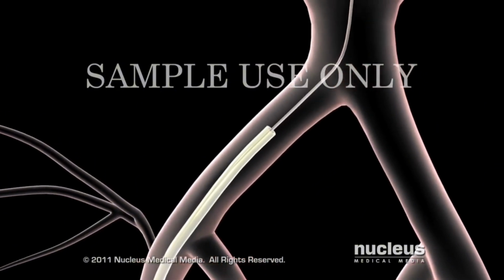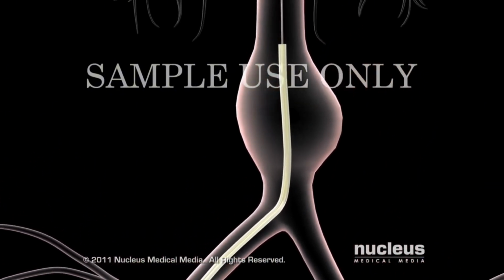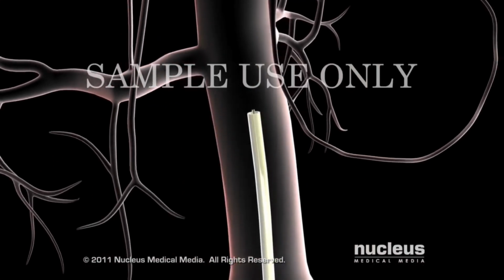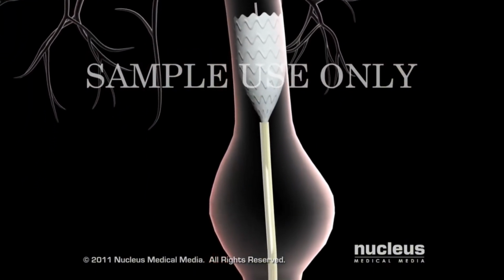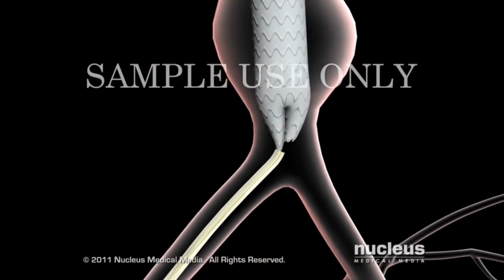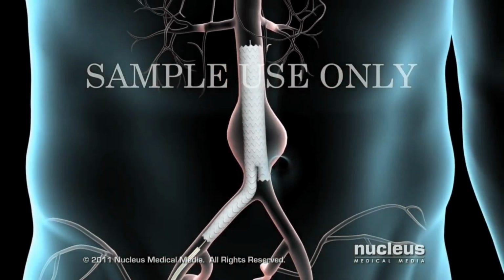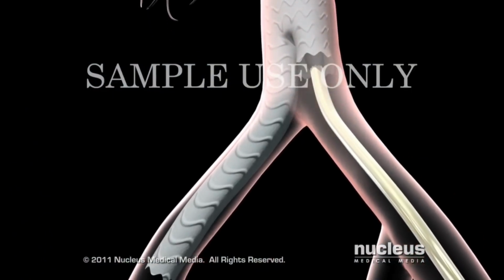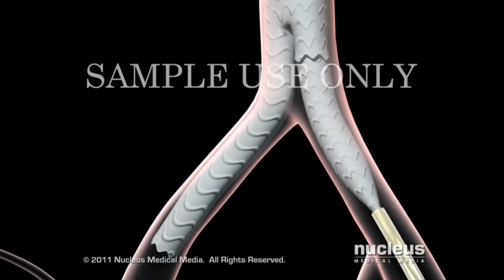A catheter, or hollow tube, will be passed over the guide wire and pushed toward your aneurysm. Using live X-ray pictures as a guide, your surgeon will pass an endovascular stent graft, a compressed fabric and metal tube, through the catheter to the aneurysm. Then he or she will open the graft, which will be held in place with metallic hooks and stents. Your surgeon may insert additional graft components to extend the graft into the blood vessels supplying your legs.